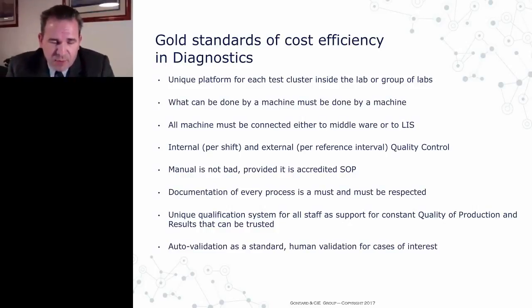Quality control and how you perform it is also a very, very critical generator of costs. There are various philosophies there, and each technology has its philosophy. We have right now groups that are big enough to have internal quality control, where we cross-reference labs against each other. We also participate in external quality control. Nevertheless, we try to make an integrated quality control system where, by unifying our platforms, we can also cross-reference our platforms easily.